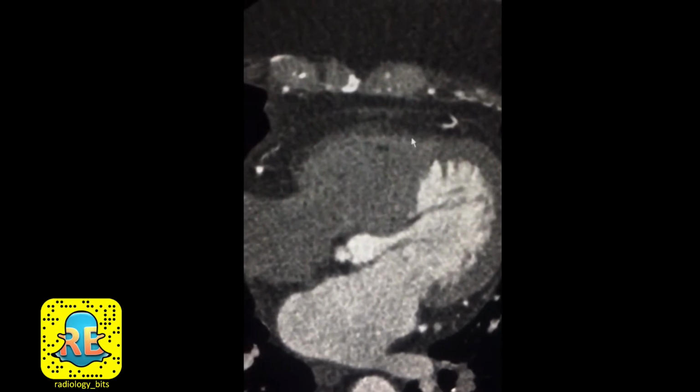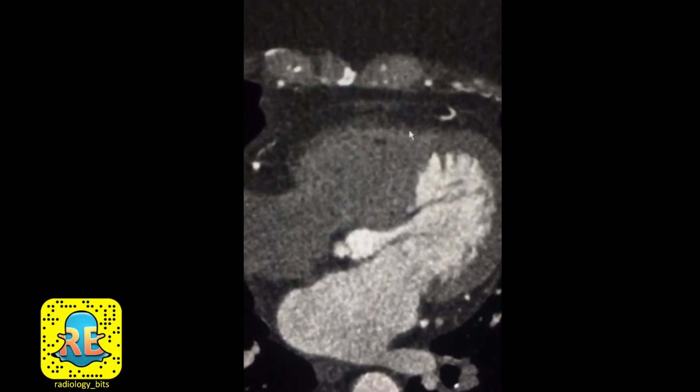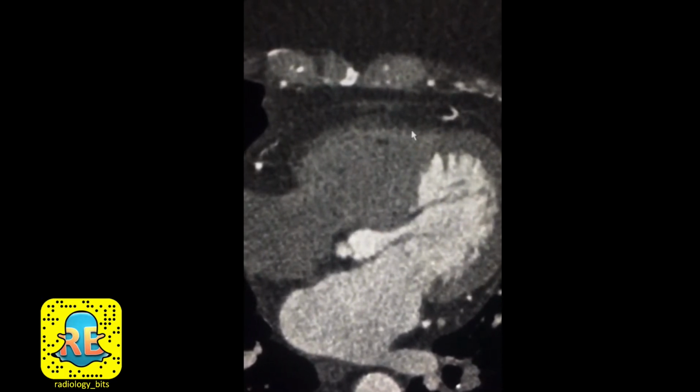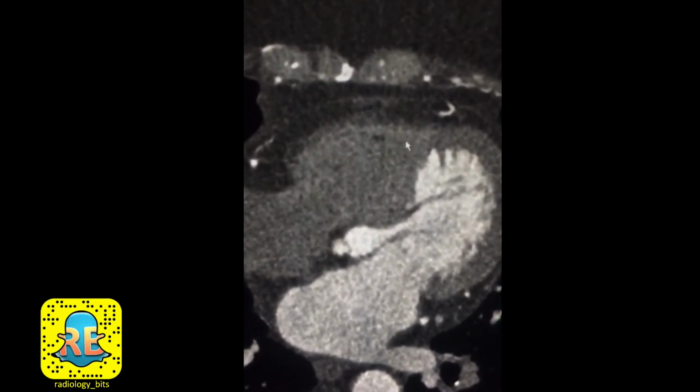Always link the appearance of fat within the myocardium with other findings and with the patient's clinical presentation. Never call an MI if you don't have signs of that or if the clinical picture does not support it, and the same applies to ARVC. Never call it if the patient was not questioned clinically for ARVC. Remember that right ventricular fat is really common in older patients.